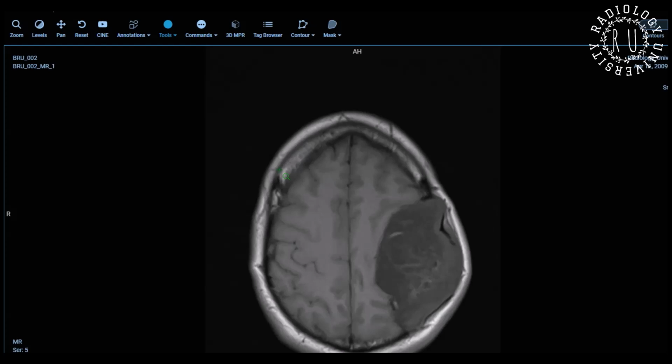You look at T1, you look at T2, and then you tell them that okay, I'm thinking about meningioma, but most meningiomas are hypointense. I'm thinking about hemangiopericytoma, but I'm not seeing the flow void. So I'm ruling out all those things, but I'm considering all the extraaxial things, and then I will refer it to MDT, and they can do biopsy or whatever they want. Cases like this, usually you make a diagnosis retrospectively, unless you have some sequence like diffusion. We do it very routinely, isn't it? Diffusion and everything. But there was a time when we didn't used to do that.